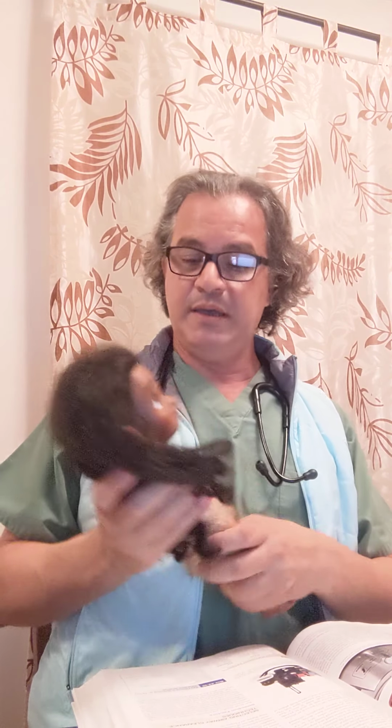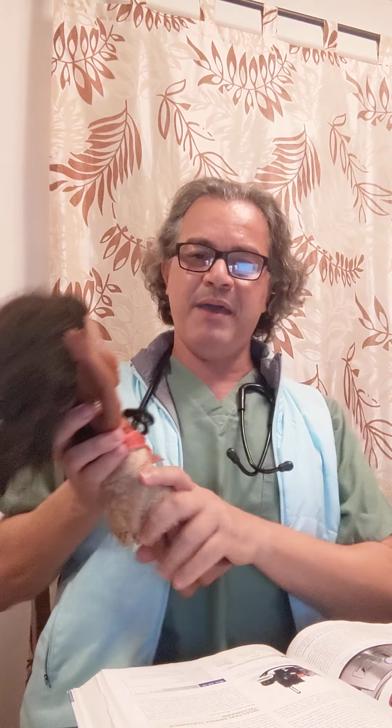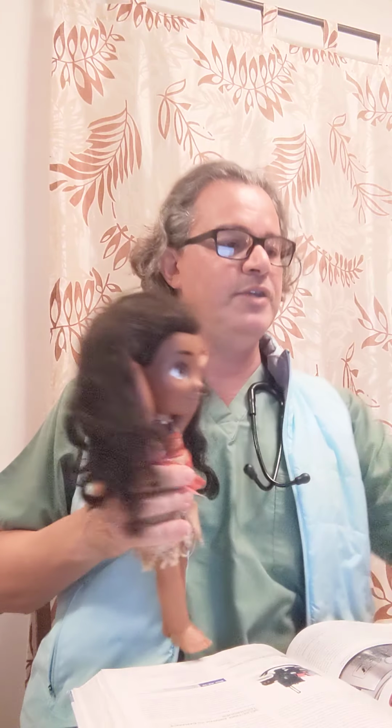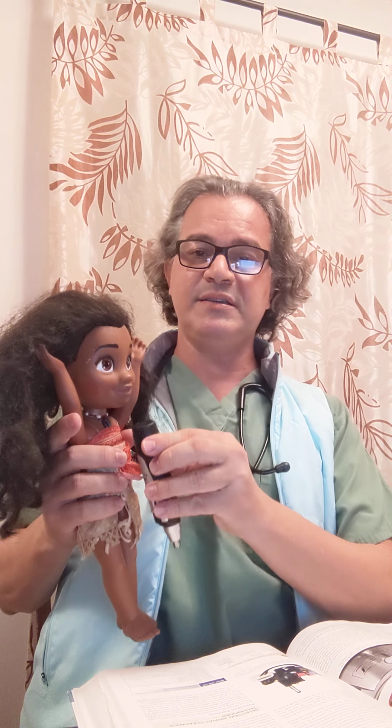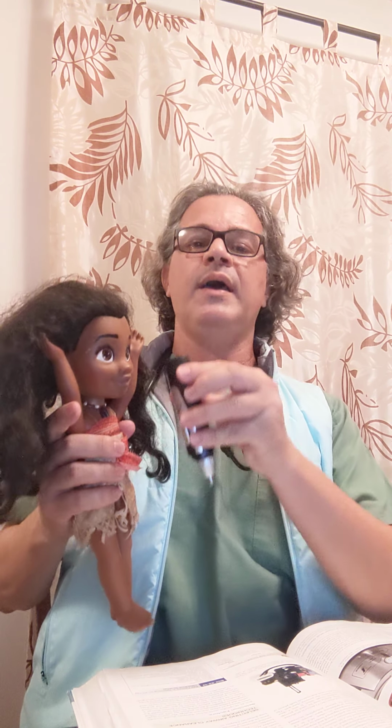I know it doesn't look like the real ones, but at least we can have some idea. This is the adult patient, where we can work manually. Everything I explained here is on the patient. The vest can be on the patient, and the patient can have the Acapella and blow out, or have the IS, the incentive spirometer, and blow in.